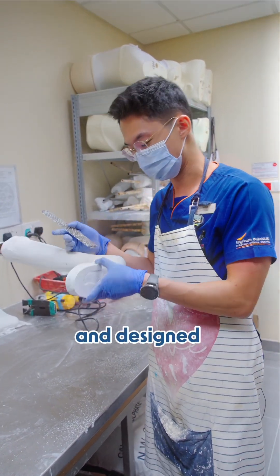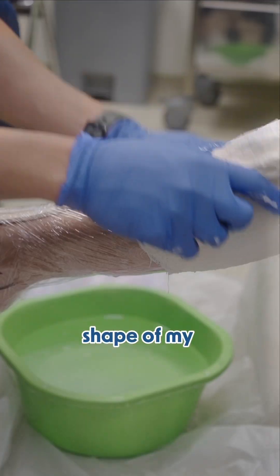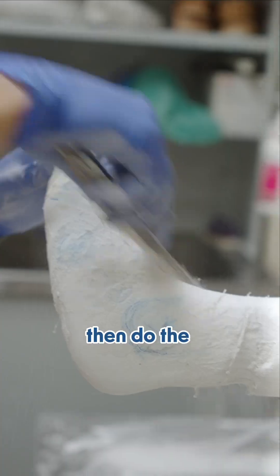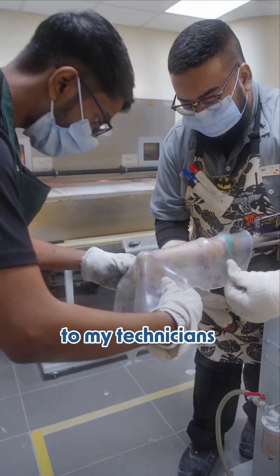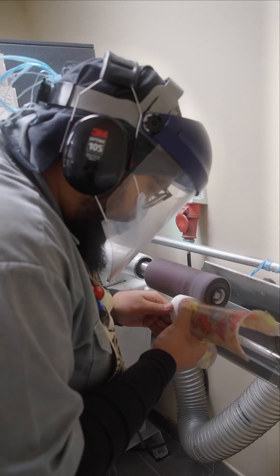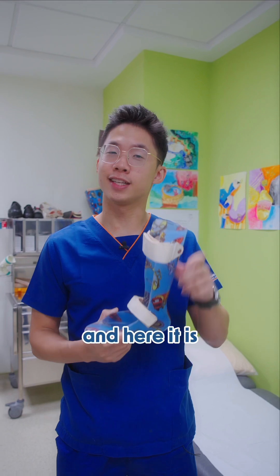Come, let me show you how we custom make and design these braces. First, I capture the shape of my patient's limb. Second, I will then do the necessary modifications required to achieve our intended effect. I will then pass it to my technicians for fabrication — the draping of the plastic and the preparation of the final device. Once it's ready, the device will be fitted onto my patient, and here it is.